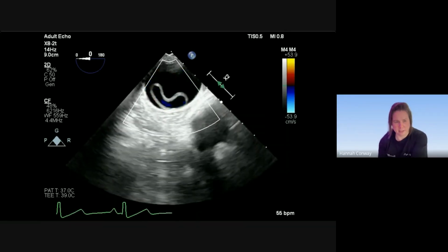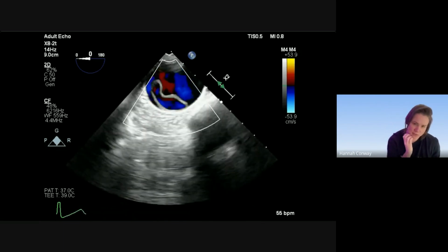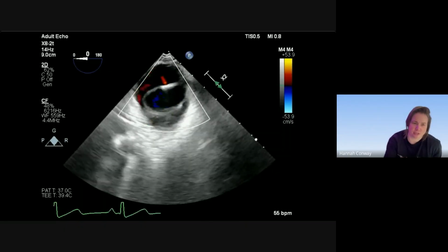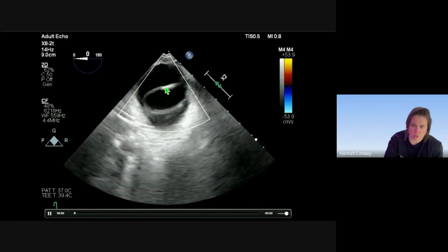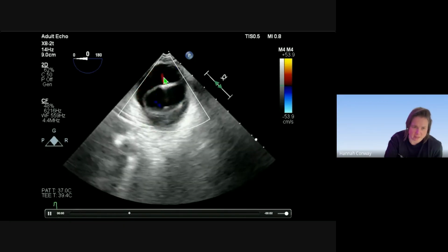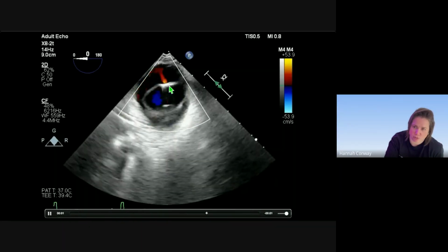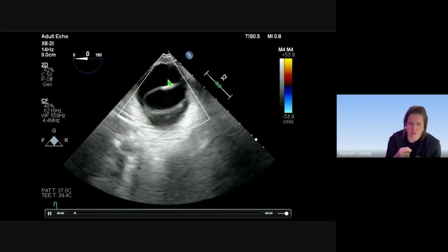And obviously the best images tend to come at the end when you're pulling out the aorta here. You can see that flap very obviously. And an interesting one just to show you, it's very common to have perforators along the false lumen or true-false lumen interface, and this jet here is just representing one of those perforations, from the true lumen into the false lumen. So if you ever see that, that's what it is. Some people have asked that in the past, what is that?